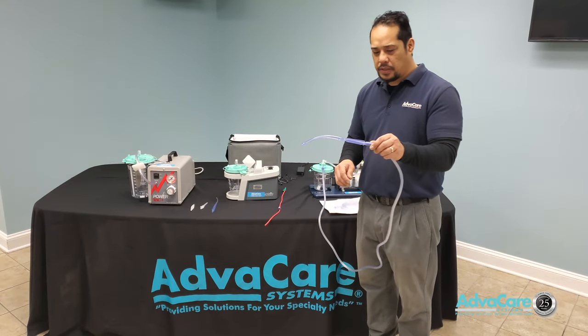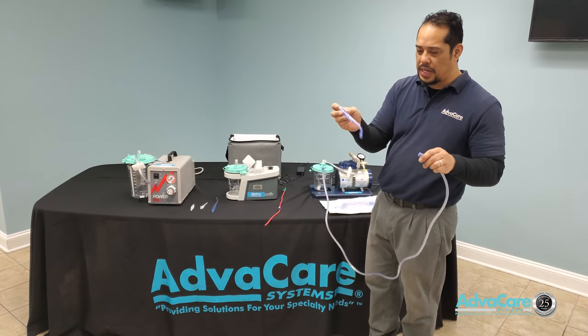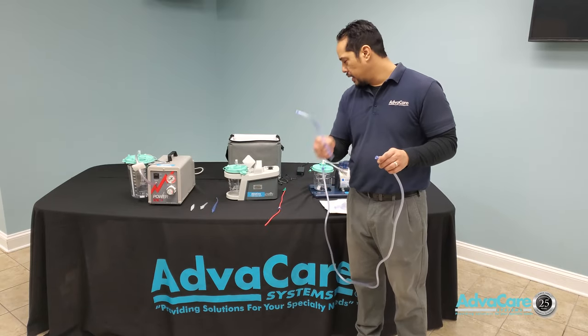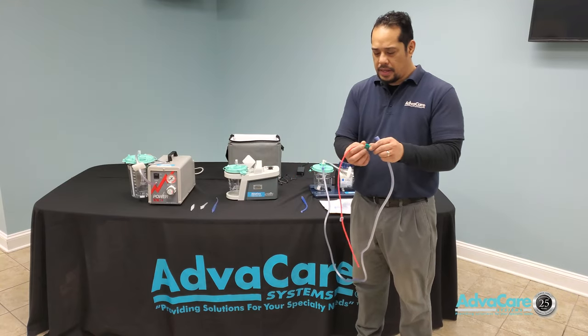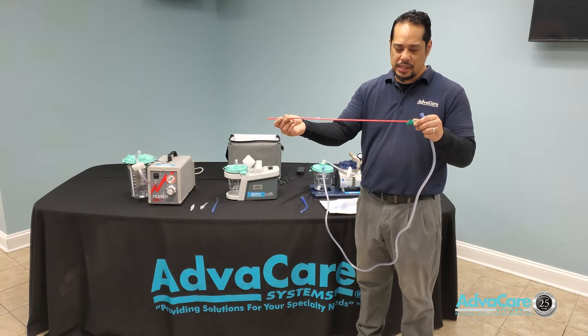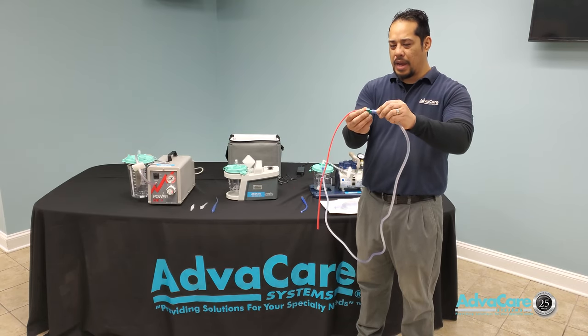The tubing is universal, so if you are going to change the Yankauer for a catheter, simply disconnect the tube, get the desired catheter size needed according to your patient, and finish the connection back to your tubing.